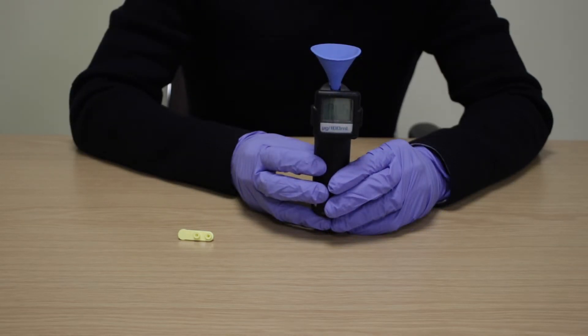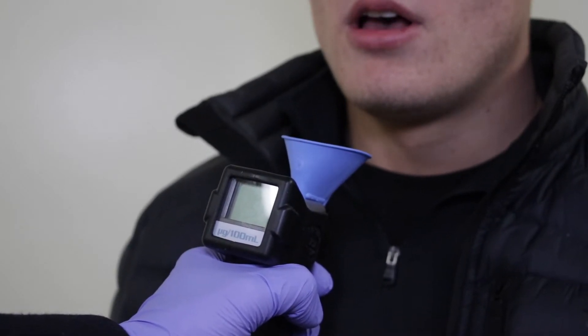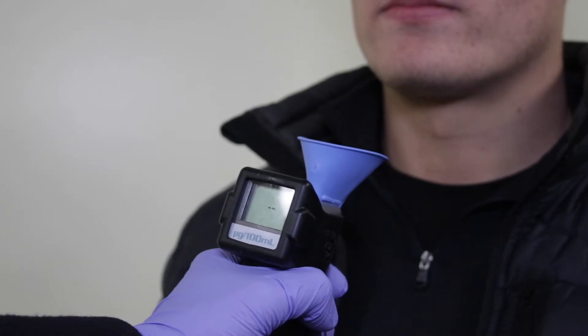The device will now show the operating temperature and then flash PAS. Hold the device a few inches away from the donor and ask them to blow into the cup until you ask them to stop. You will hear a click indicating there is enough sample to run the test.